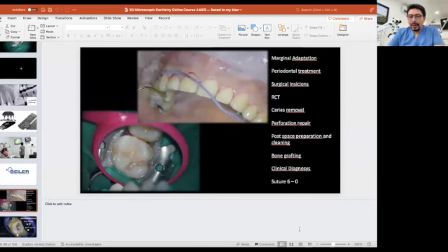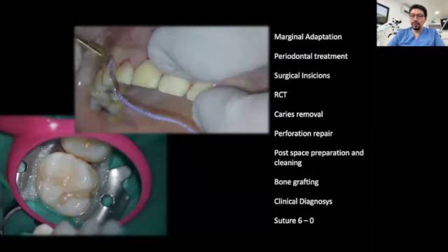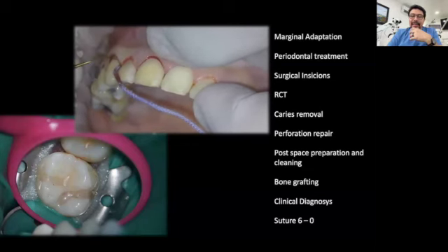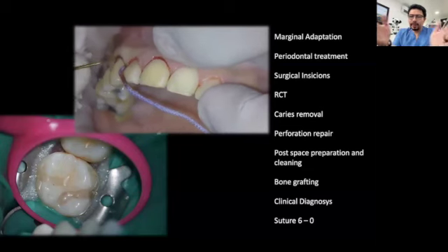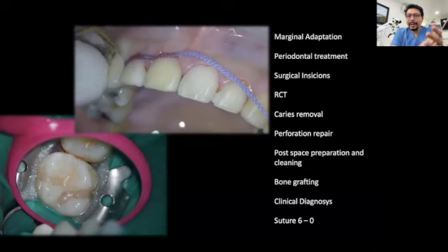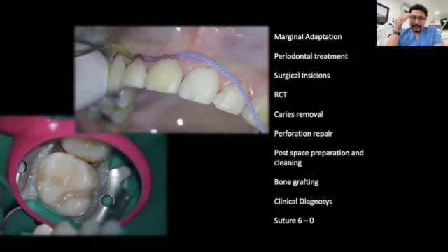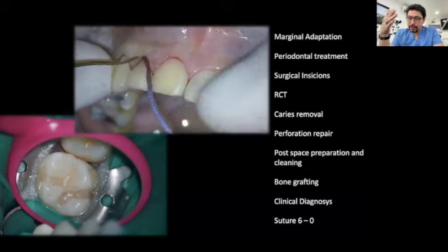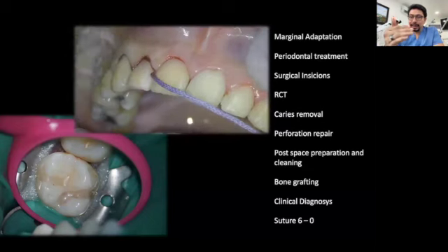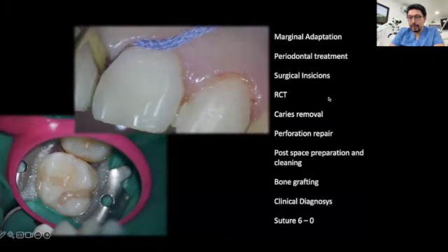Okay, guys, we are almost just in time. As I mentioned to you, that video is like a résumé of many things that we have been talking about. That video has some clinical tips and tricks. It's around 12 minutes long, but I wanted to mention to you personally the importance of understanding where to place the mirror, and that when you detect where you need to place the mirror, don't move it. Keep it in that position and just angulate the mirror for trying to obtain a proper vision in the specific area in which you are working.